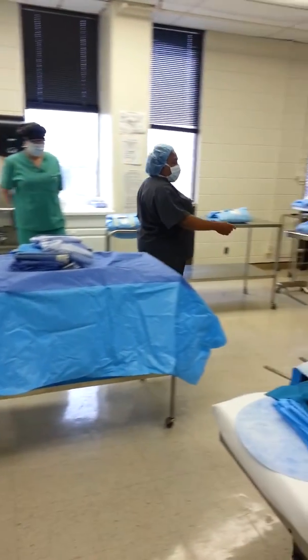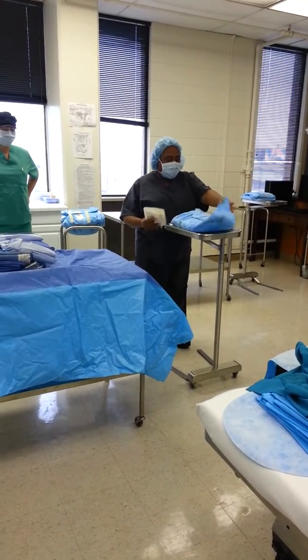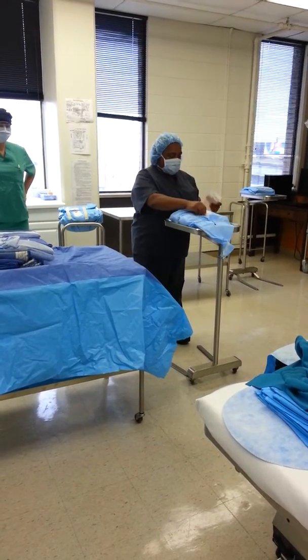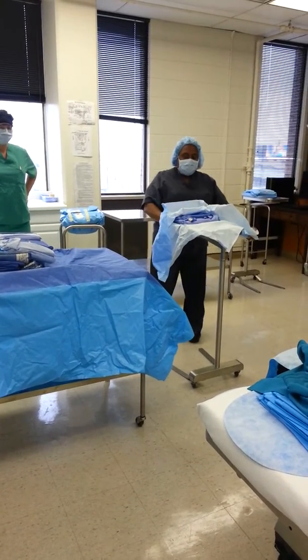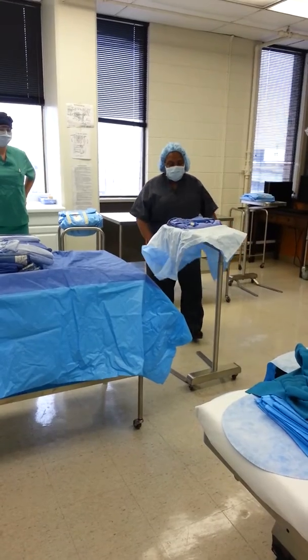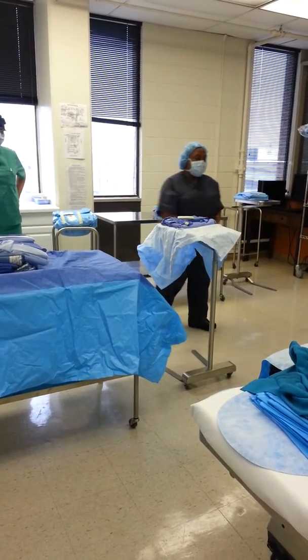Okay, and then I bring my mayo stand closer, still that distance apart, open away, right and left, or left, right, it doesn't matter, and to the side, to me. And I flip my gloves.